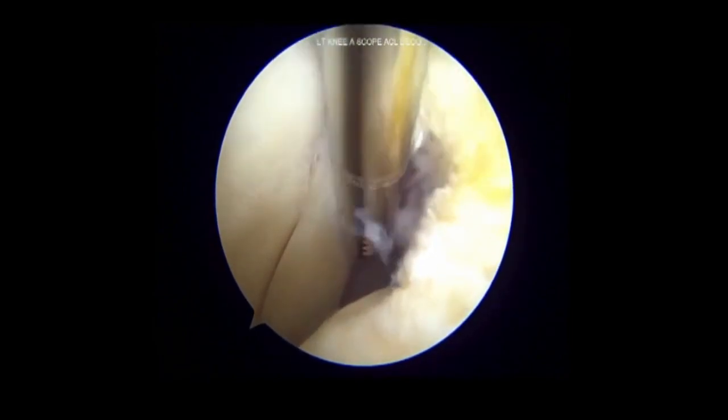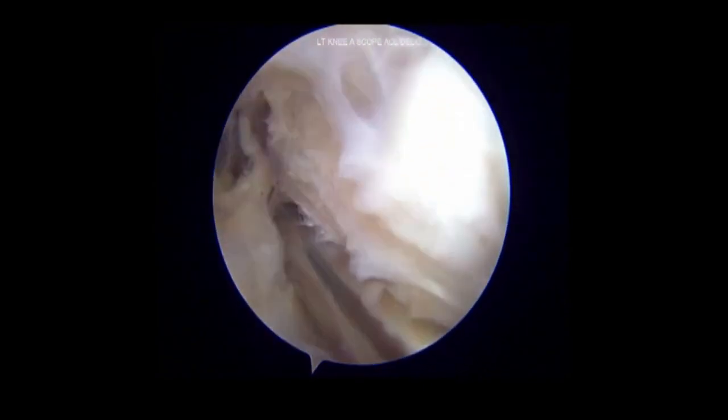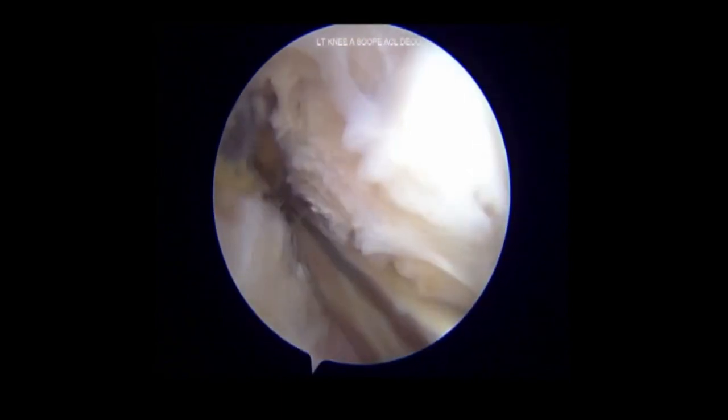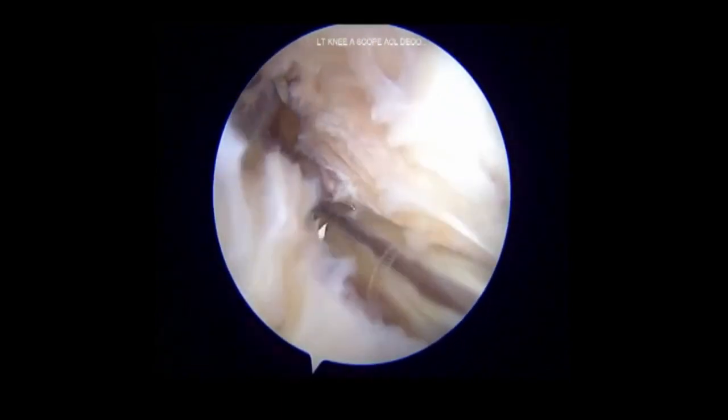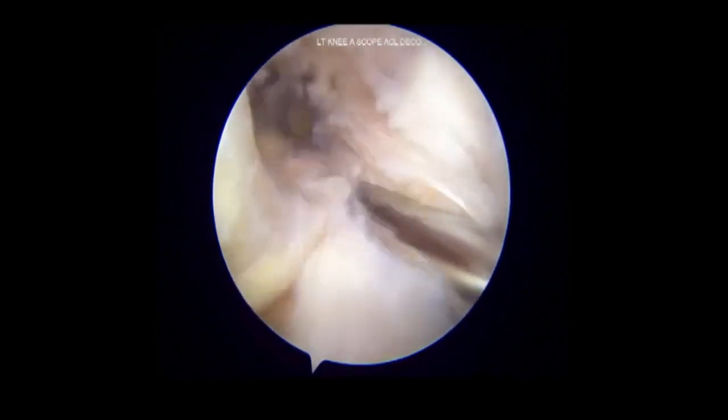The scope is shifted to the anteromedial port and the shaver tip coming through the anterolateral port is used to shave the remaining anteromedial bundle. This also ensures clearance of the posteromedial compartment.